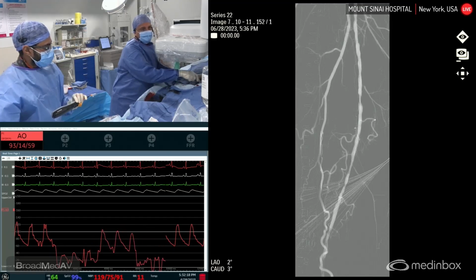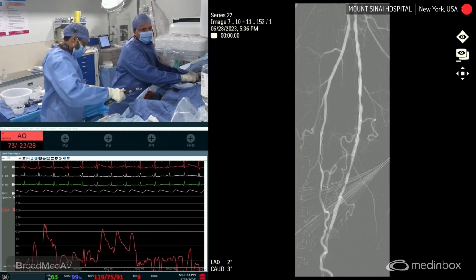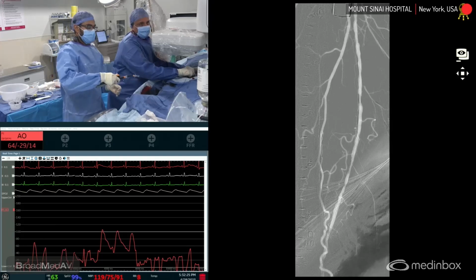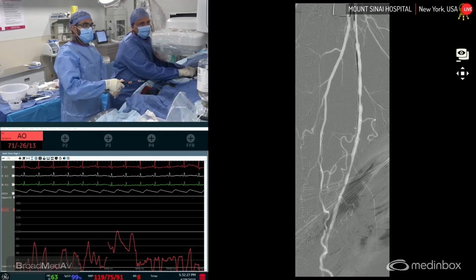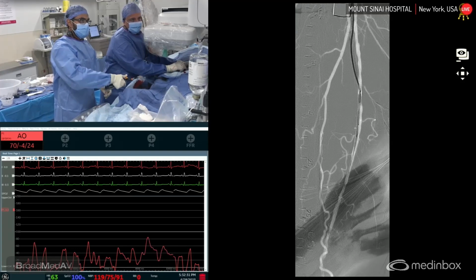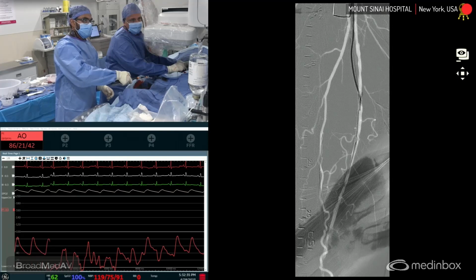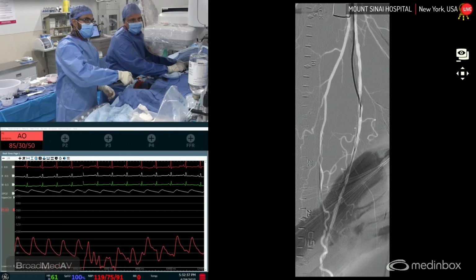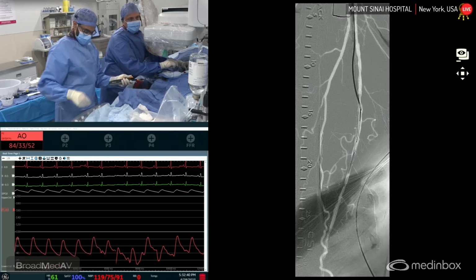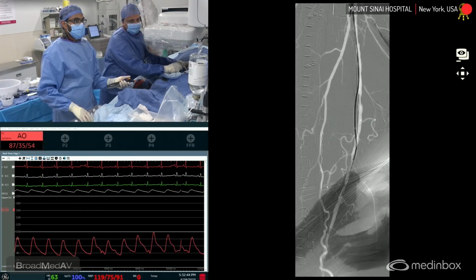So now I'm going to go in and I'm going to start at that area. I'm just going to do a single 2-quadrant cut initially, and then decide if I need to do a 4-quadrant cut. So I'm coming down. I'm just going to pick the quadrant I want to cut. Okay, I'm cutting medially here. Turn it on, please. So I'm just going very slow. Off. I'm going to stay in that quadrant. I'm going to come down to here. On, please.